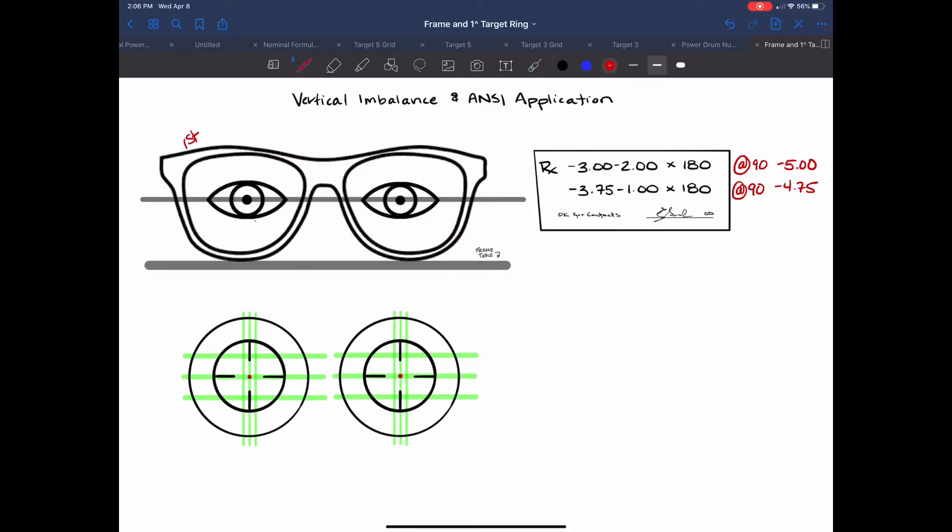So first we'll center this one and when we look into the lensometer we're going to be attempting to center this one perfectly. We're going to locate the optical center we're going to be able to move the frame table up and down move the lens back and forth and center this optical center. Then we're going to spot it.